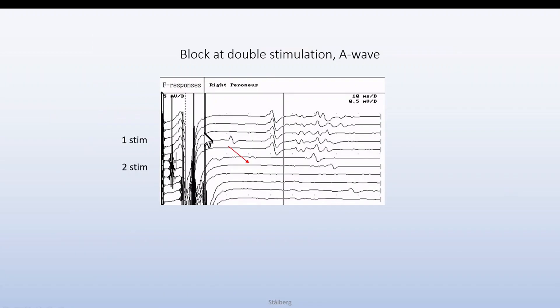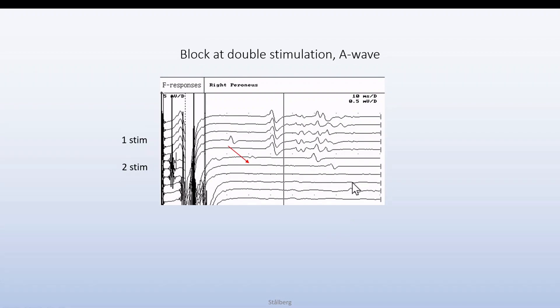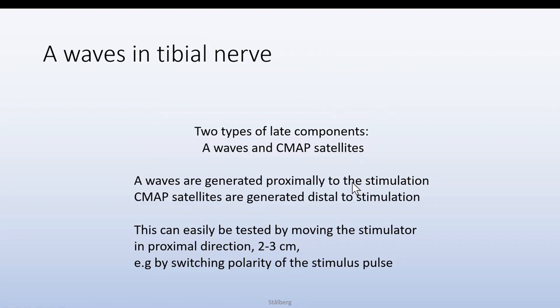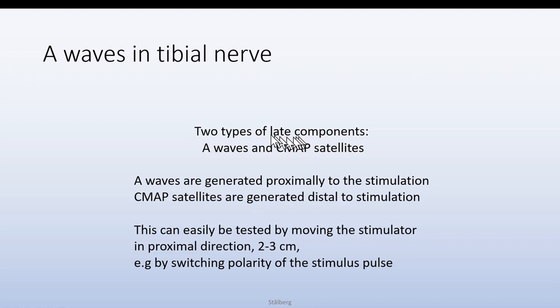Here is an example with single stimulation showing late components, and double stimulation showing no late components at all. In the tibial nerve, where we particularly often have these late components, we have both A waves and particularly CMAP satellites.